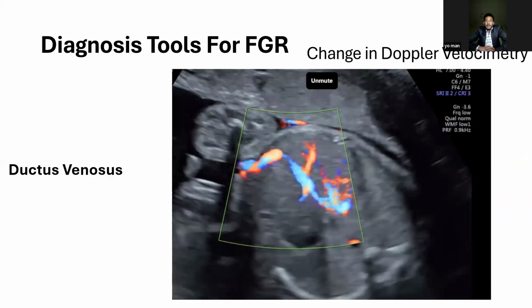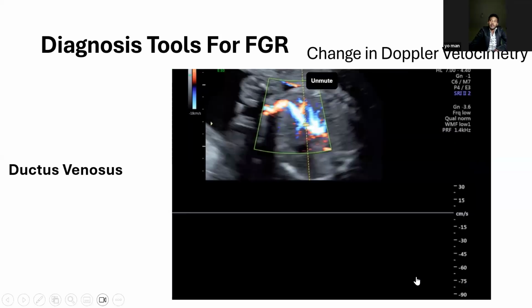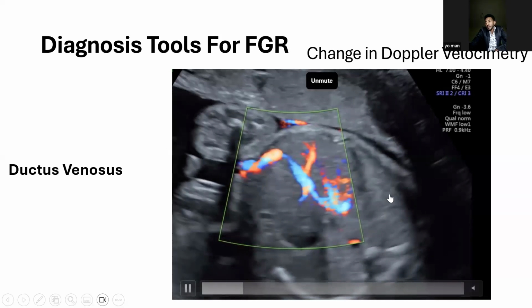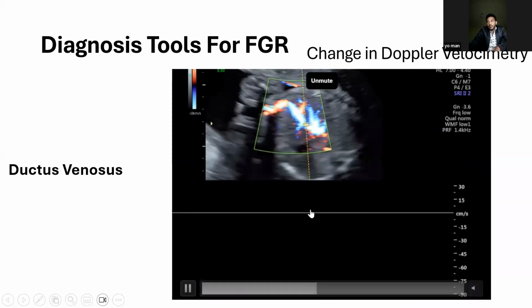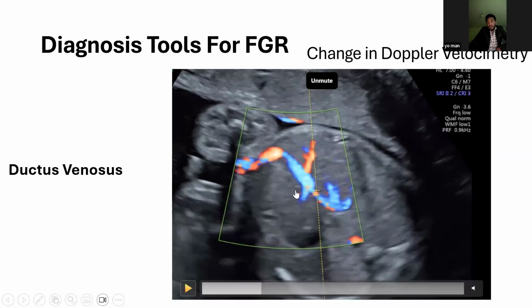For the ductus venosus, the best view to map it is a transverse abdominal thoraco-oblique view, okay? Here the lung is seen because it's oblique, and the abdomen is here, and you will map the ductus venosus right above here at the point where the color aliasing happens, decrease again, and map the ductus venosus as it enters the diaphragm and then eventually the IVC, okay?